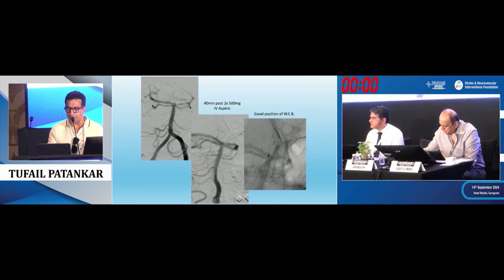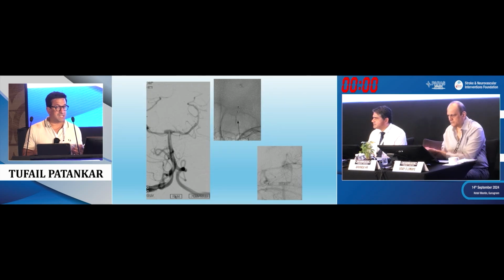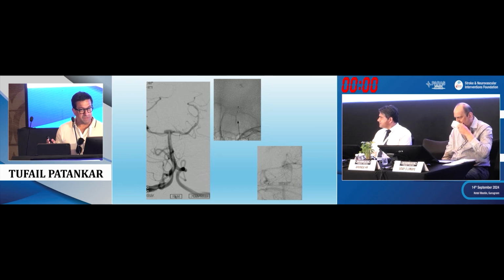I'm going to stop here because I think I can show you trouble. But both the devices will have problems. Thromboembolic events with web, I know it's 14%. With Contour, I know it's about 13 to 14%. That's a ballpark figure. Symptomatic is around 3 to 5%.